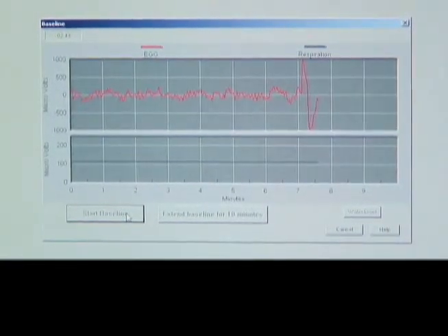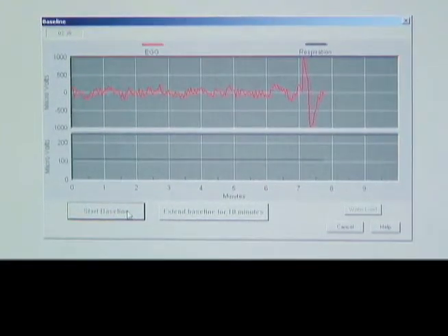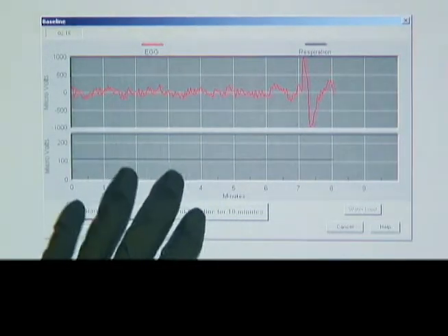A deviation in the signal, like here, there's a few things you want to do. First, you want to make sure the patient hasn't moved. If the patient has remained completely still, you want to try to adjust the equipment. You may want to replace the leads. You may want to make sure that everything is plugged in properly into the module as well as into the computer. And you just want to make sure you have at least 4 good minutes of signal without a deviation or artifact.